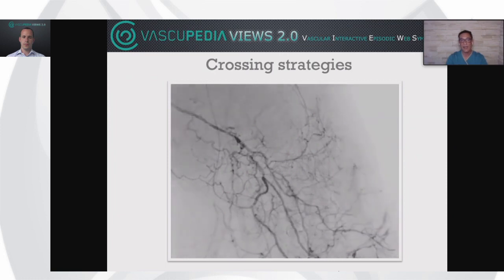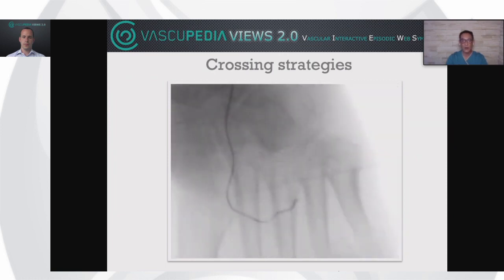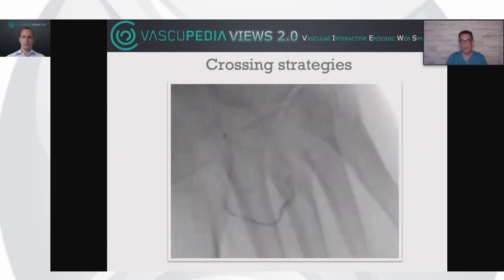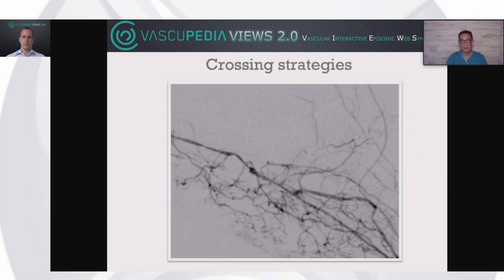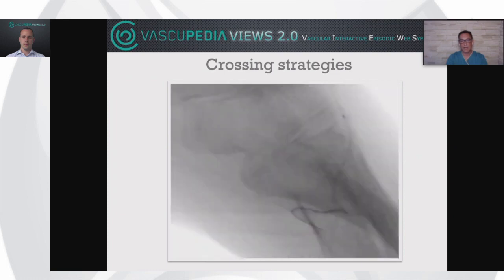This is a hibernated arch. And then we drill again our wire up to the point in which we could pass to the metatarsal, change again the projection to the lateral view, retrieve the wire, and we finally could make it.